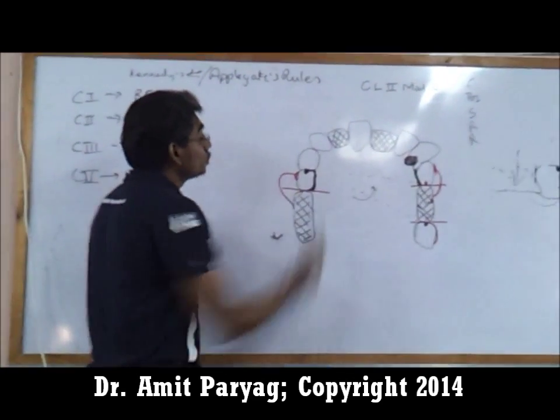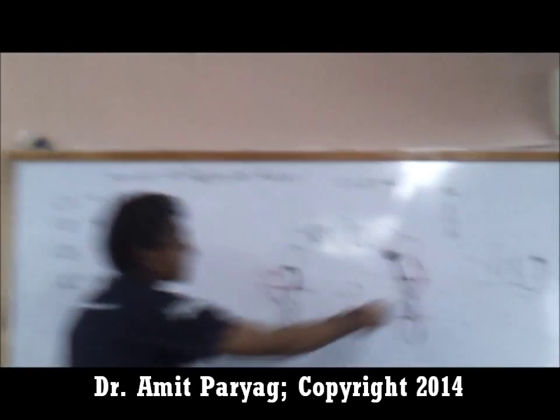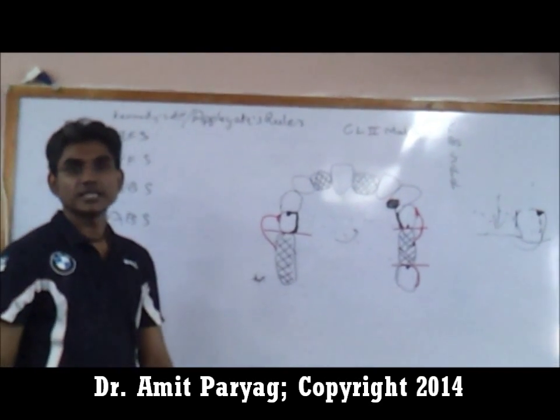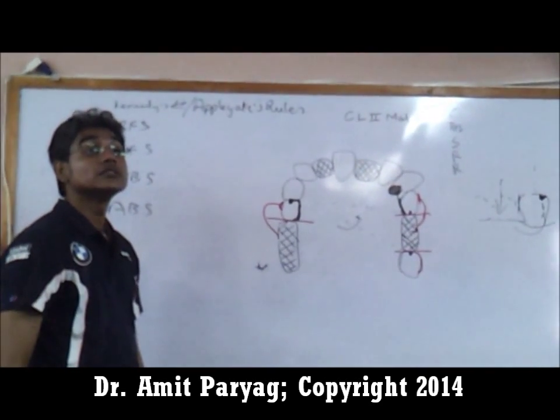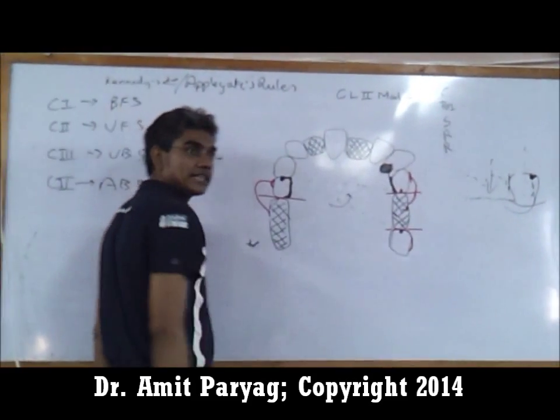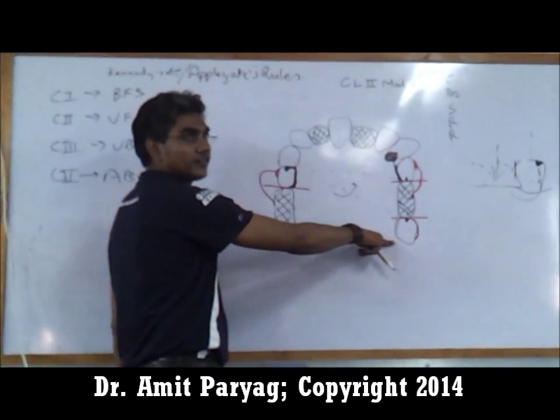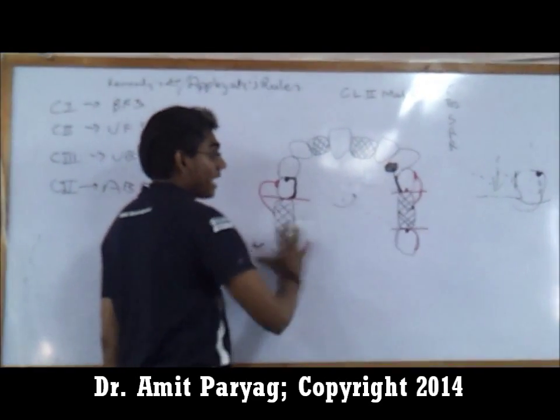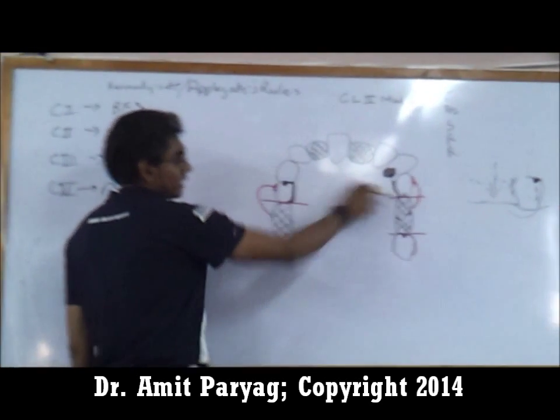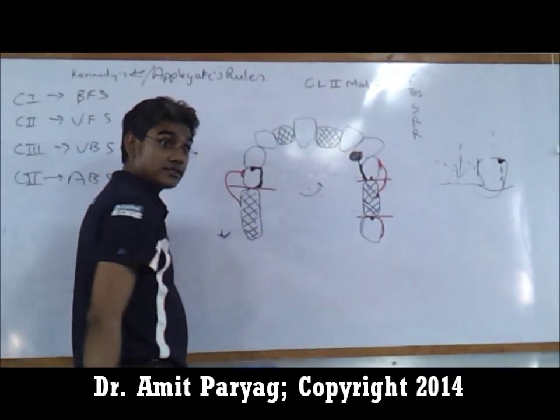Cover the entire cingulum surface. Do I need indirect retention on this side? No, because I have two sets of clasps pulling this into position, so I don't need indirect retention on that side. For a class I bilateral situation where this tooth is not present, yes — because I would have another fulcrum line set up acting in that direction.